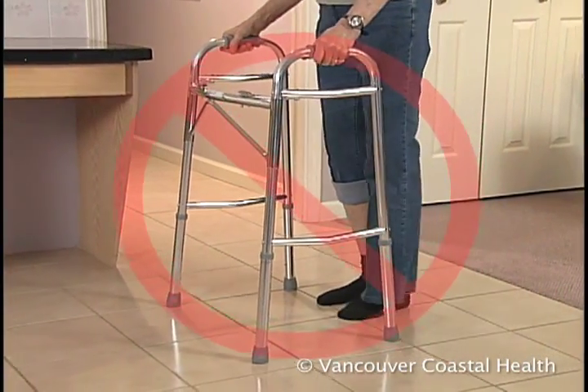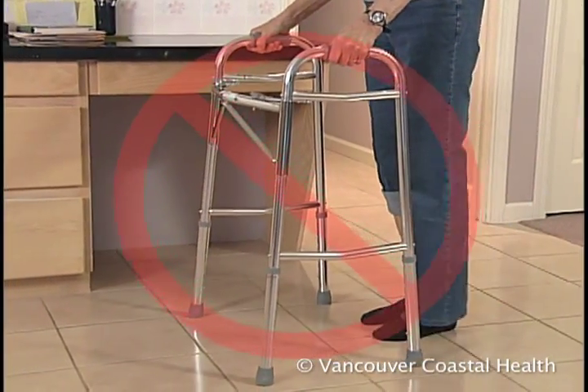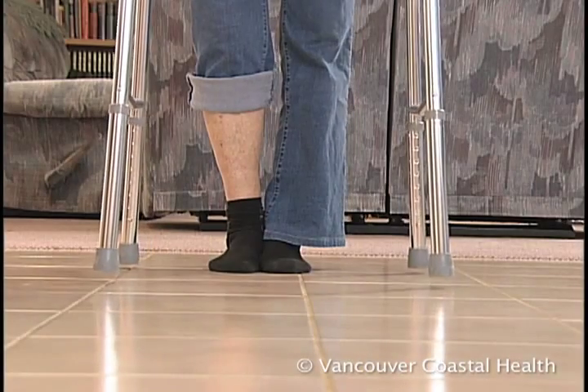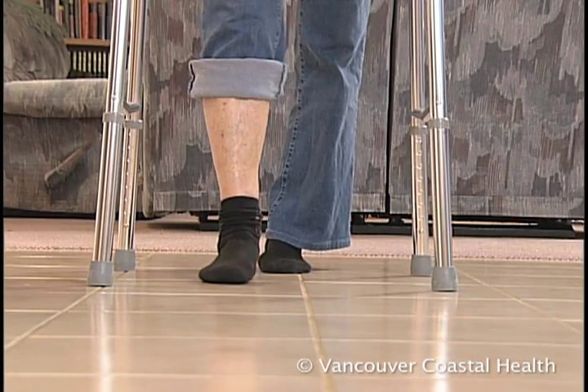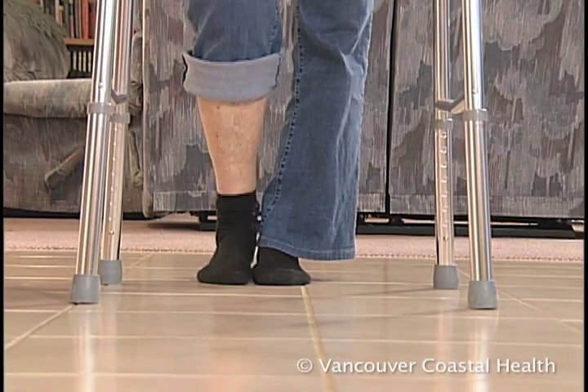This is incorrect walker positioning because all four legs are not on the ground. To correctly position it, make sure all four legs contact the ground before stepping into the walker. This is necessary to keep your balance.